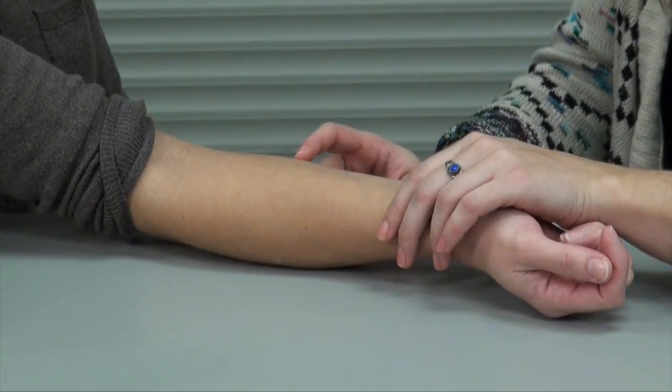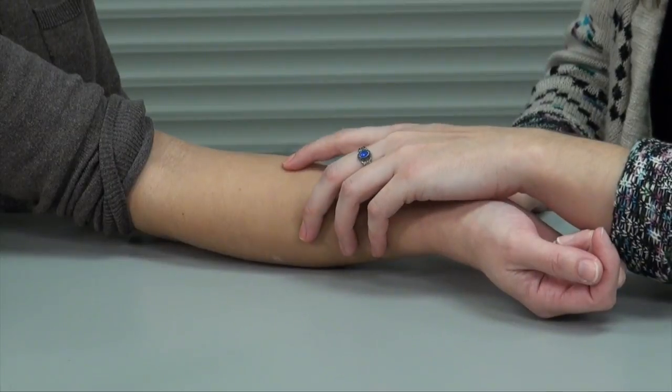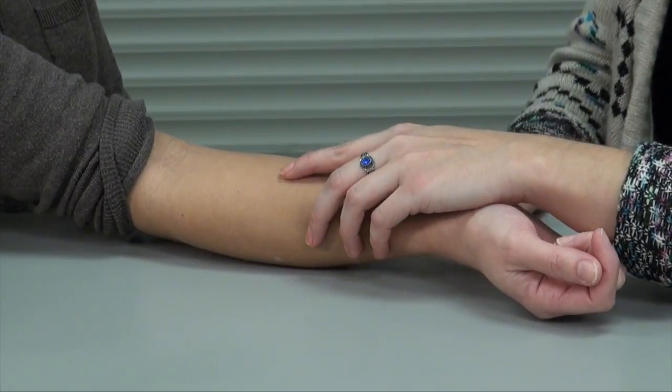You want to use the tip of your finger at the site where the injection was administered and palpate from side to side, feeling for any induration underneath of the skin. When you're reading the skin test, you want to ensure you're not measuring redness or bruising, as this does not indicate a positive skin test.